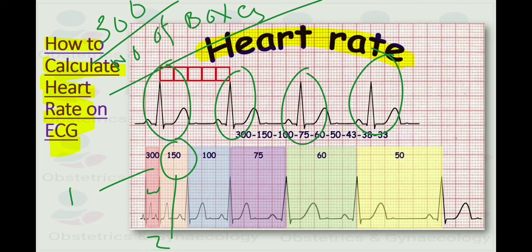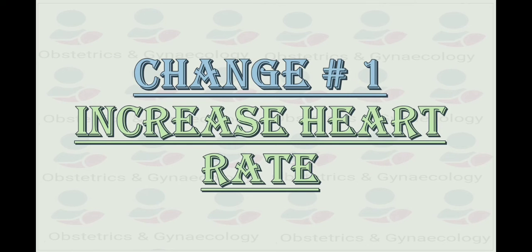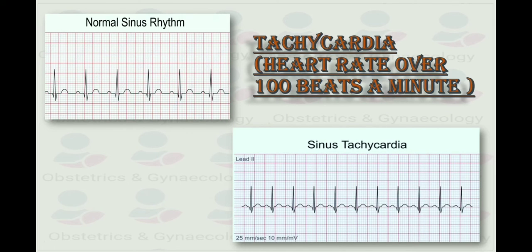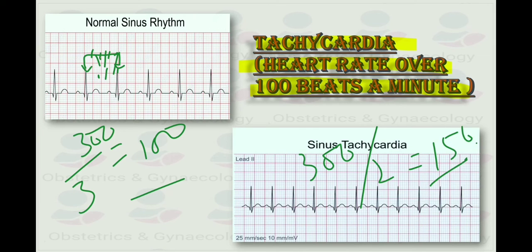Change number one in pregnancy is increased heart rate, which you can see on the ECG strip. There is tachycardia, meaning increased heart rate over 100 beats per minute. In normal sinus rhythm, if you count the number of large boxes between two QRS complexes, here we have three large boxes. So 300 divided by 3, almost 100 beats per minute. But when you check the ECG in pregnancy, we have fewer boxes. 300 divided by 2 gives almost 150 beats per minute. That is what we see in pregnancy and is considered normal. This is called sinus tachycardia. Although 150 is quite high, up to 120 is considered acceptable.